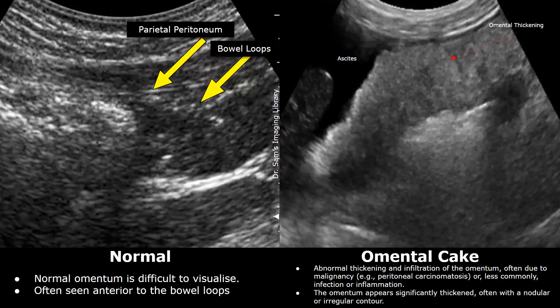In normal cases, the omentum is not really visible on ultrasound. It might be visible just anterior to the bowel in most cases, but in normal cases we do not really see it. This thin structure is the parietal peritoneum. The bowel loops are posterior to the peritoneum, and the omentum is between these two layers.